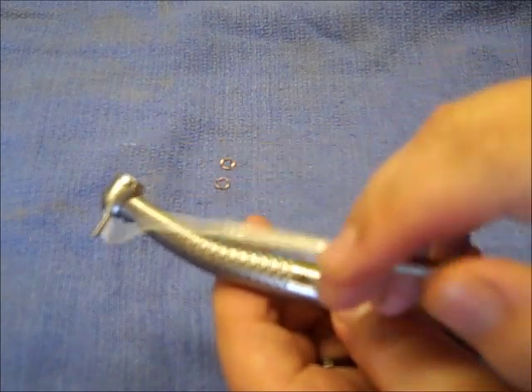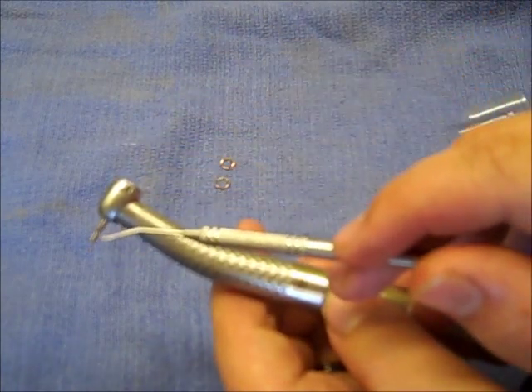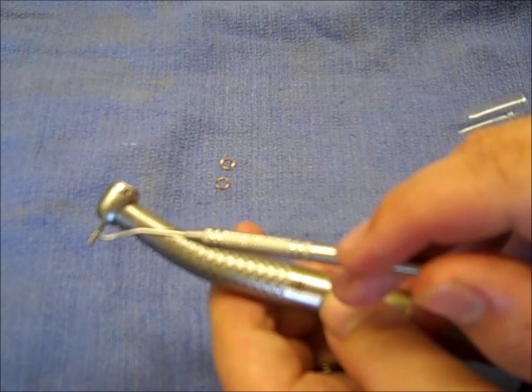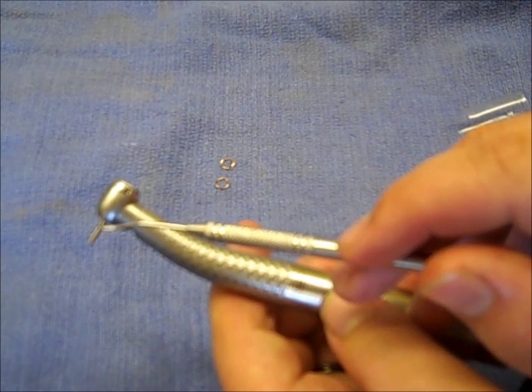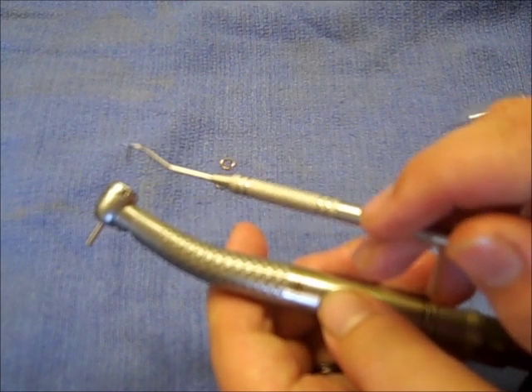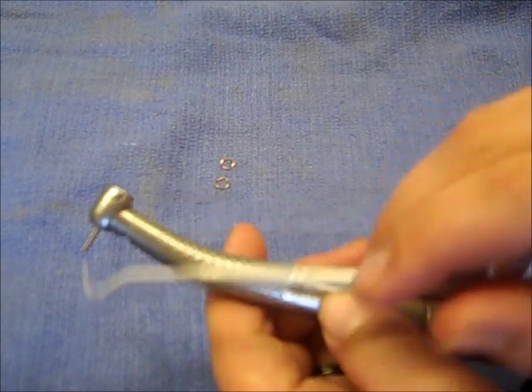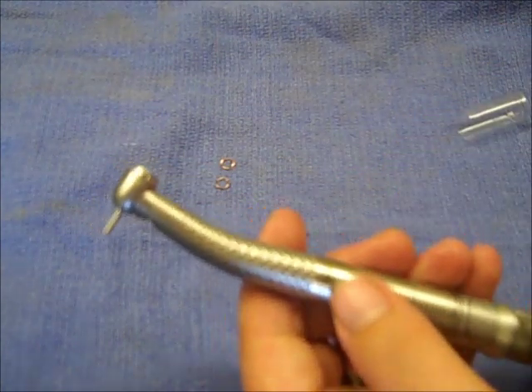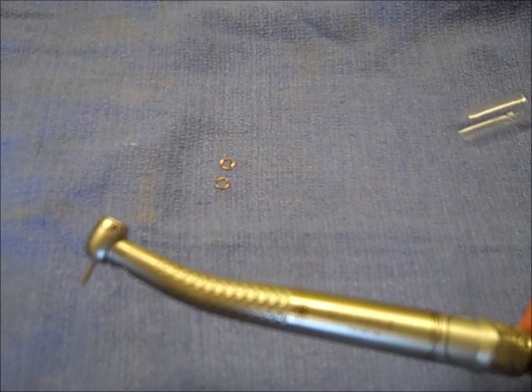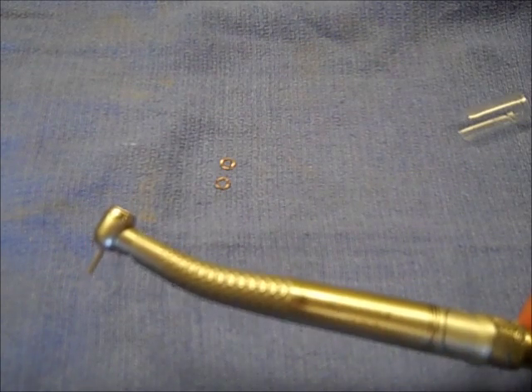I'll go through the installation order one more time. When installing the turbine: spring washer first, then white Teflon washer if you have it, then O-ring in the head of the handpiece, then put the turbine in the head. In the end cap: spring washer first, then the O-ring, then the end cap back on and you're ready to run. If you have any questions, call 1-800-950-9431 or visit handpieceturbine.com. Thank you.